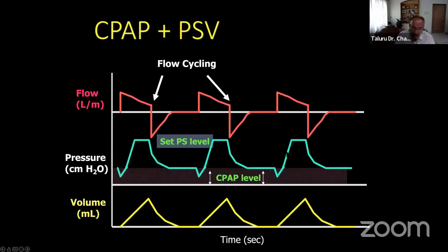And another common misconception is CPAP. What is CPAP? What is pressure support ventilation? See, when a spontaneously breathing patient in heart failure or sleep apnea has only some obstruction to breathing out, or is producing some PEEP, in a spontaneously breathing patient we call it CPAP. But we don't have much application for it.